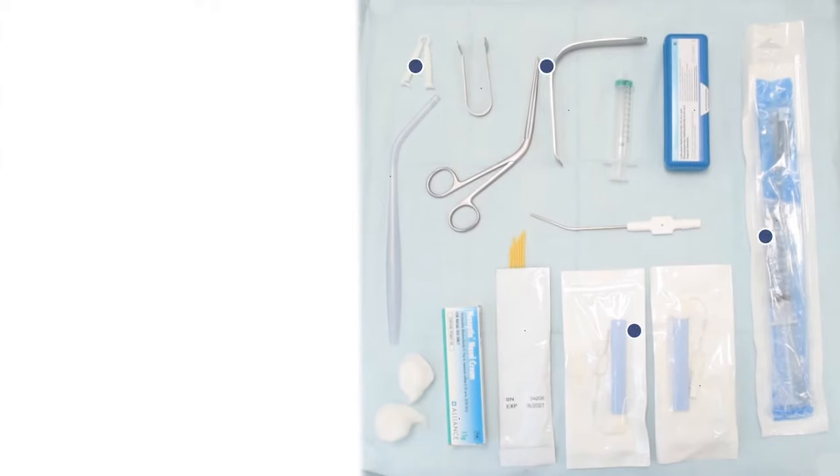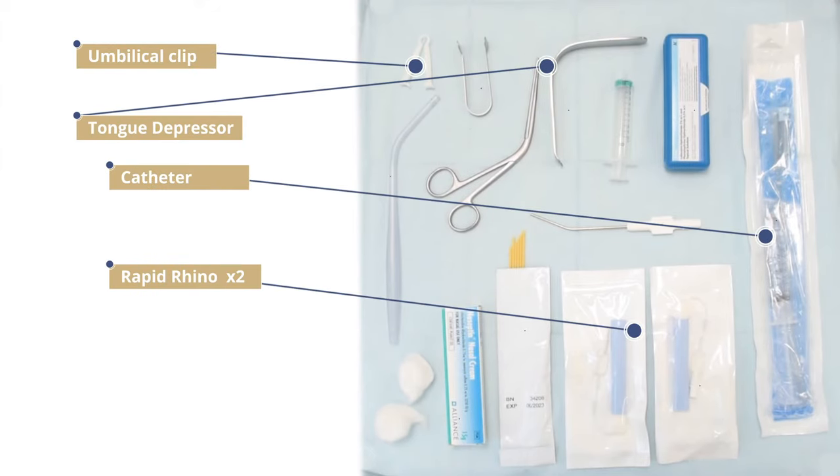You need to prepare: a size 12 Foley catheter, an umbilical clip, gauze, tongue depressor, and two further rapid rhinos. A Foley catheter is not licensed in the UK and, where able, specialised posterior packs should be utilised. However, this method can be used where specialist packs are unavailable, using readily available equipment and a well-recognised technique.